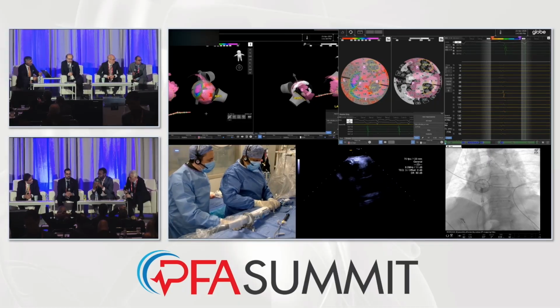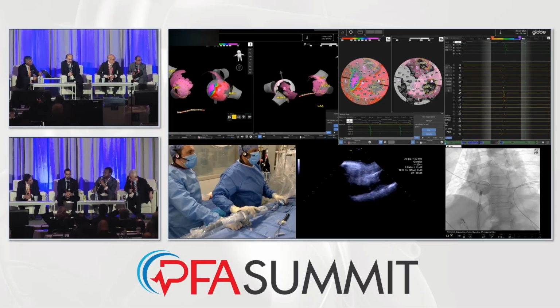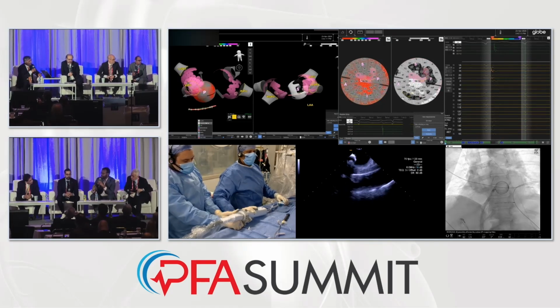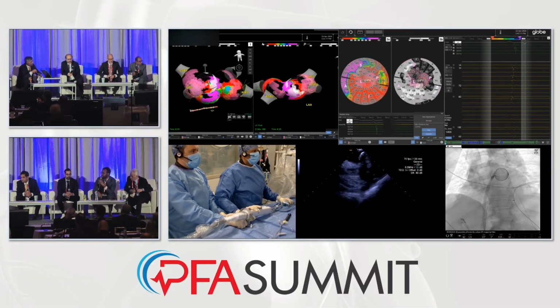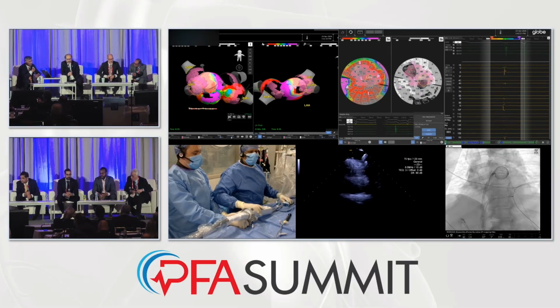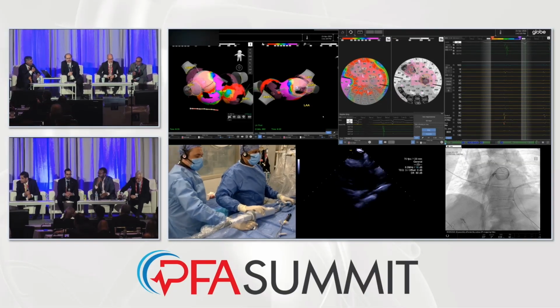The durability data is obviously very impressive, but we saw the initial data and then started looking at contact being important, and tried to optimize. This was already forward integrated, having that in place. So do you think a lot of that is the contact, the mechanism of assessing contact here? I think so. One thing that's very clear is proximity is key when you're doing pulsed field ablation, and there's no better proximity than contact with tissue.